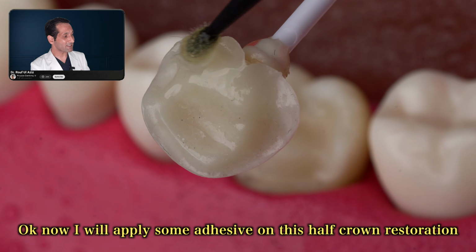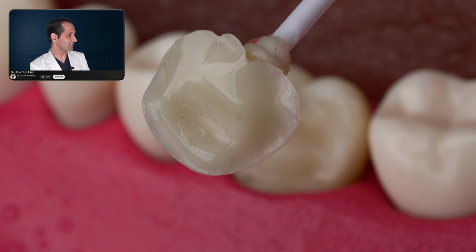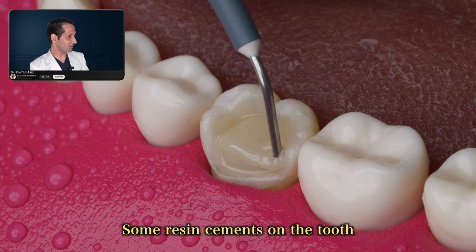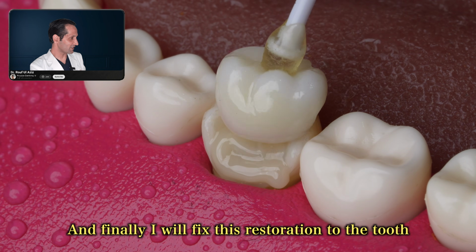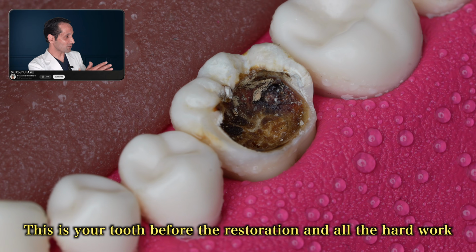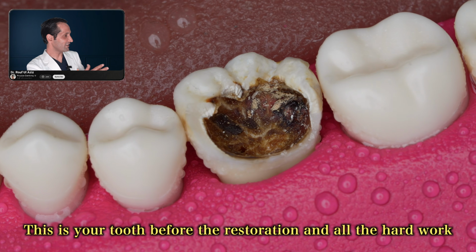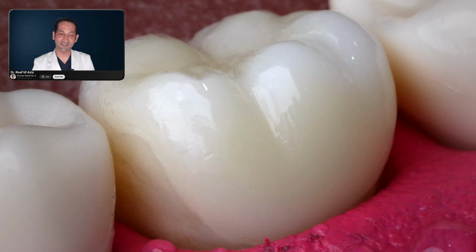Okay, now I will apply some adhesive on this half crown restoration, some resin cement on the tooth, and finally I will fix this restoration to that tooth. Okay, all done. Now let's see the final results. This is your tooth before the restoration and all the hard work, and now boom, this is the after.